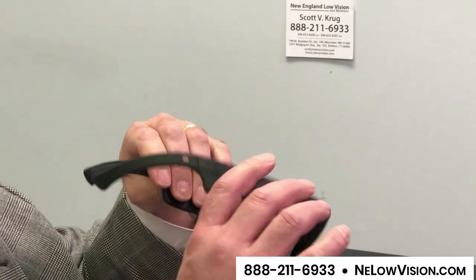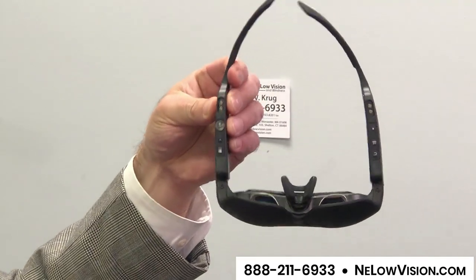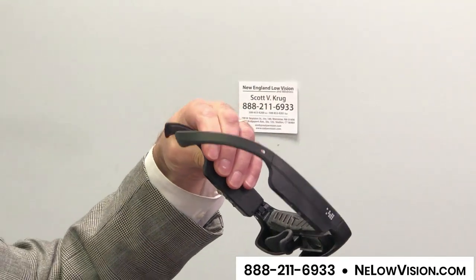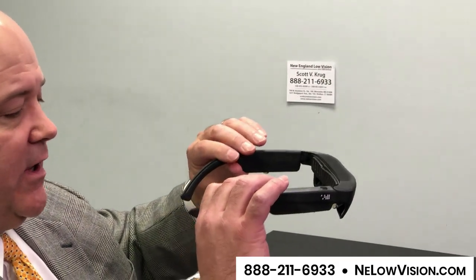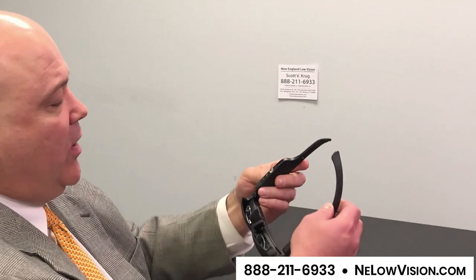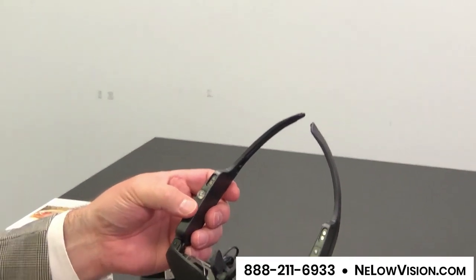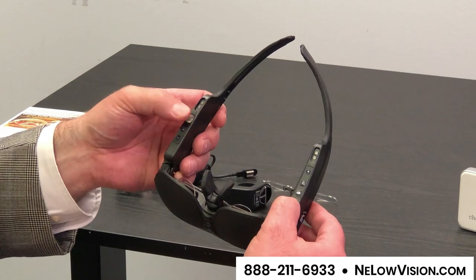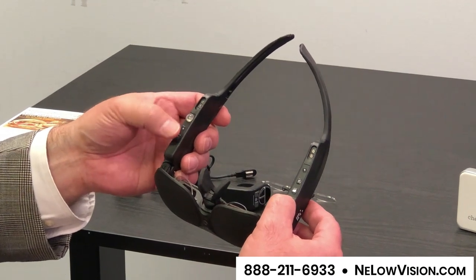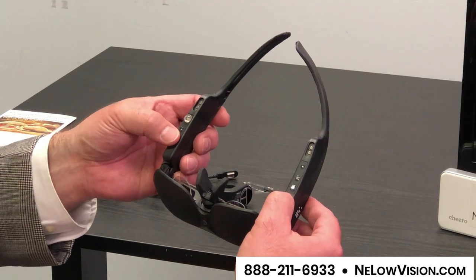What this is is a military grade pair of glasses and inside is an Android tablet. There is a battery built in and almost a full computer — a full Android tablet. It looks like there are very few buttons on here, but underneath the glasses there is an on/off button, and these two buttons here are one of three different ways a user has to control the magnification.